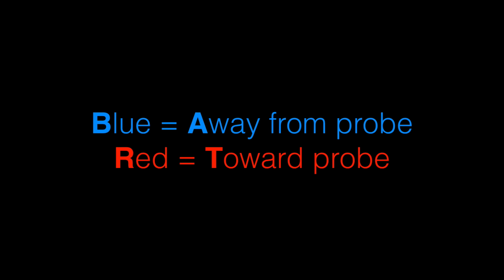The Doppler effect means that a moving object will change the frequency of sound. So as objects are moving, the frequency of reflected sound is altered. And by interpretation of that change in frequency, the ultrasound machine can denote motion. The most common one you may see is color Doppler, and the acronym to remember is BART, or blue away, red towards, meaning blue is coded for motion away from the probe and red is motion towards the probe.